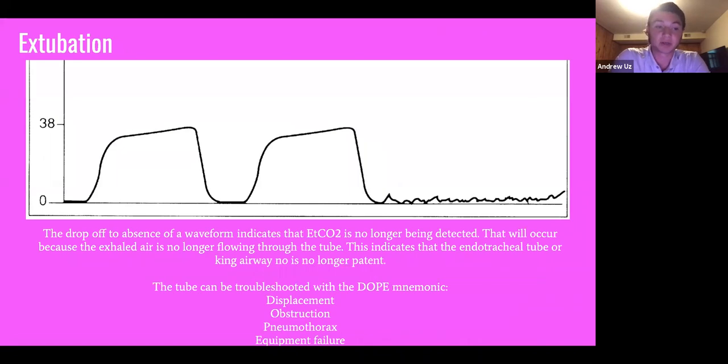They're extremely sick and extremely sensitive, and so they can't tolerate that tube being misplaced even for a short period of time. So we need to make absolutely certain that every single breath that we give them is going into the lungs. The way we do that is by looking at the end tidal CO2 waveform. So every time you squeeze that bag, you're going to get one of these square waveforms, like I said, that indicates a breath.